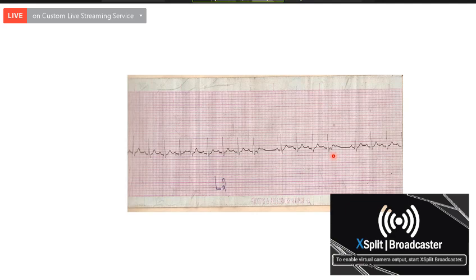But what can it do? It can travel upwards, it can depolarize the atrium, and also it can depolarize the sinus node, thereby resetting the sinus node. It resets the sinus node, and that will result in a widened interval between the beats which enclose the blocked atrial ectopics.